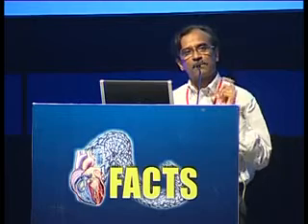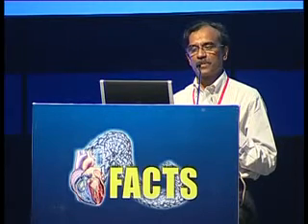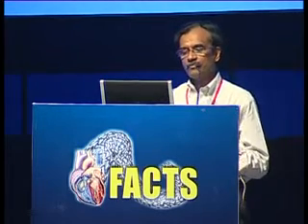There is bound to be some difficulty in tracking the catheter across the mitral valve. Another reason may be inadequate septal dilatation with the 12 French dilator, and you may need a 14 French dilator to enlarge the size of the septal puncture.